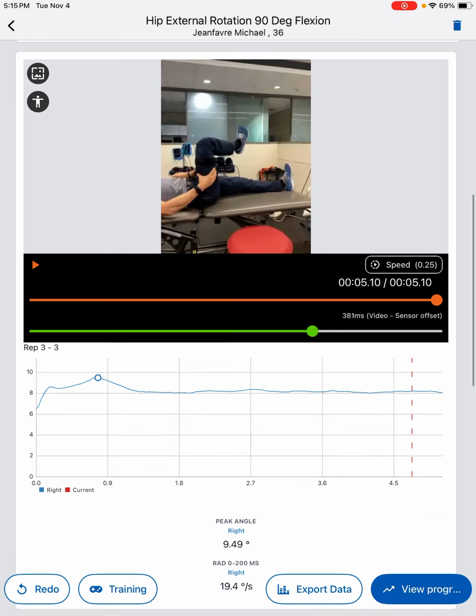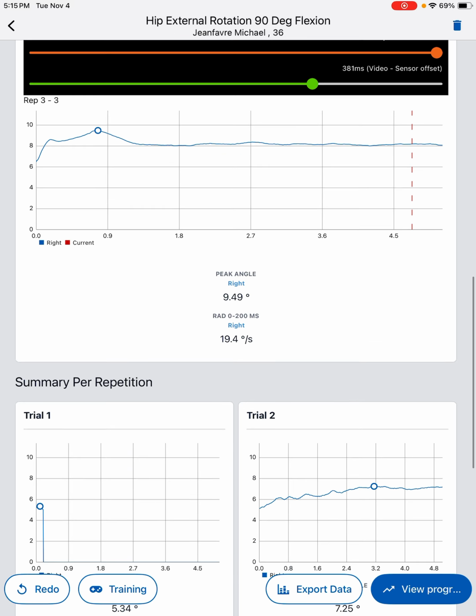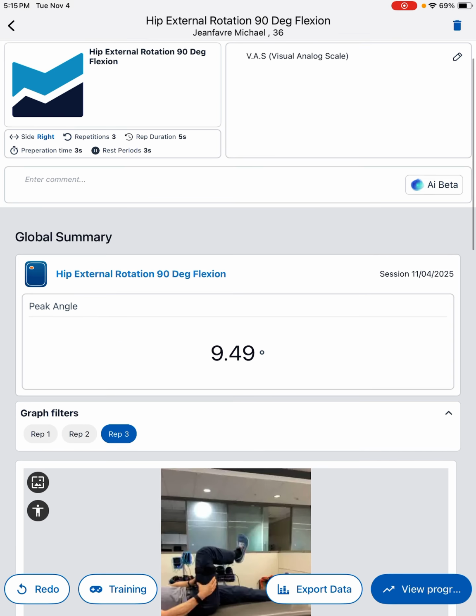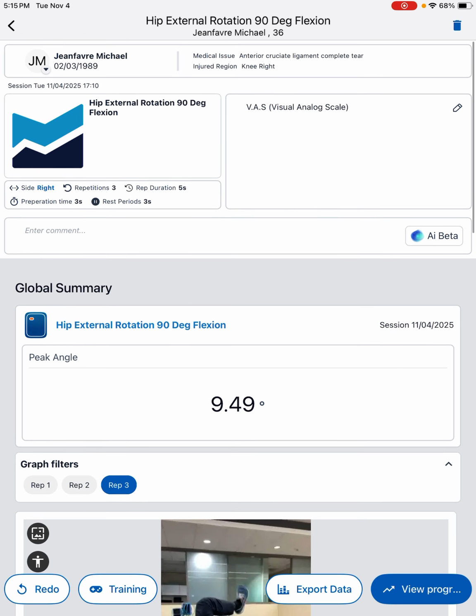I was hopeful that you may be able to provide some insight or suggestions on how I could make a custom test or assessment, and or potentially if you all would be willing to put this into the stock assessments, as it is a very common orthopedic evaluation and is, again, giving us different information than just the seated internal and external rotation.